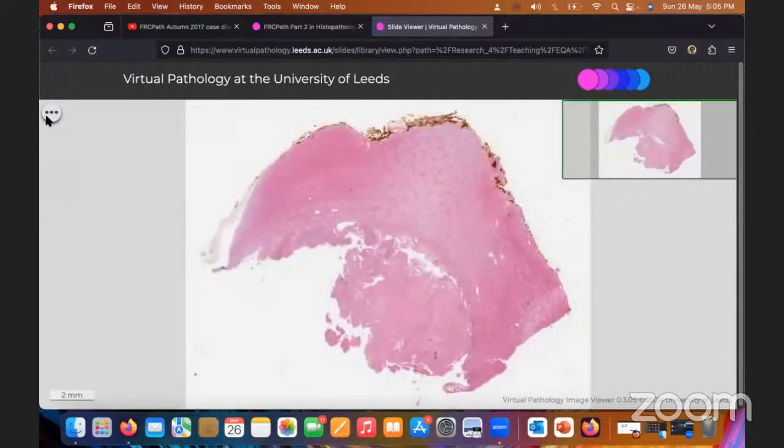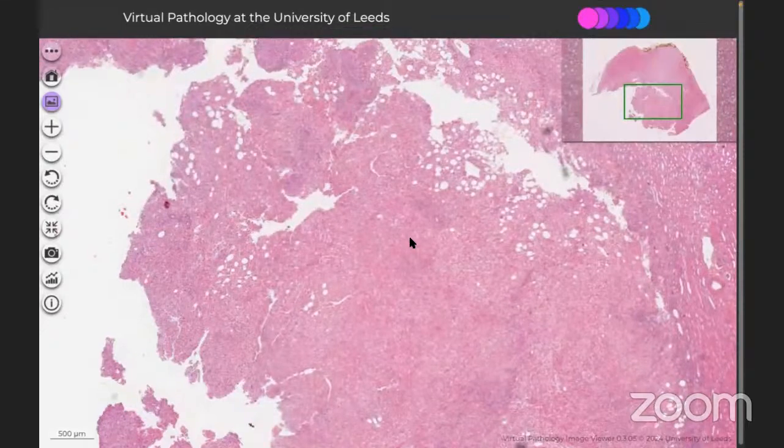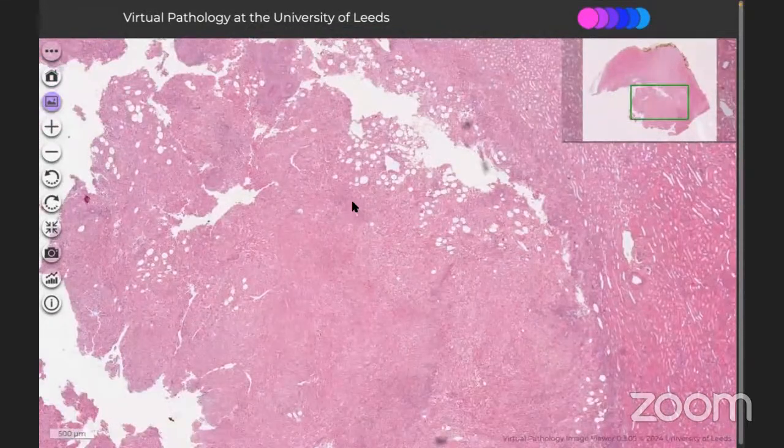So this is a section from our low magnification. We can see the lesion is well circumscribed and the ink margin is visible. The lesion is quite away from the ink margin. And if we move closer, the lesion is actually showing a tripartite appearance.